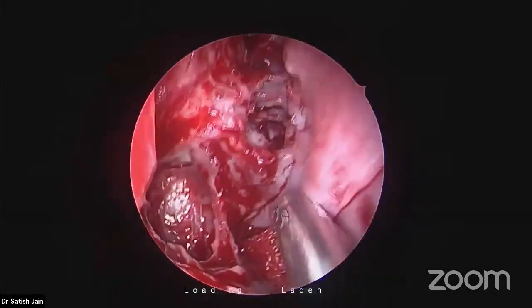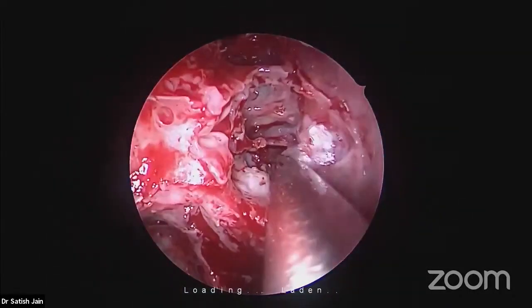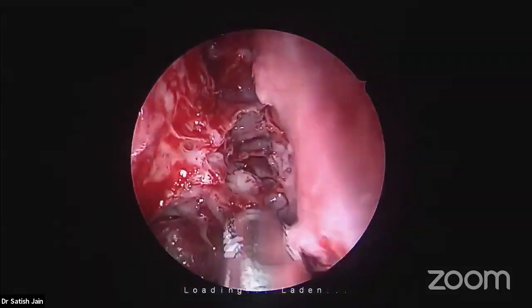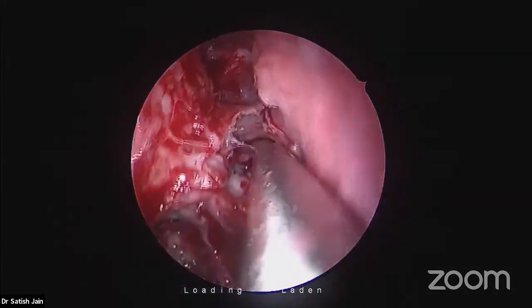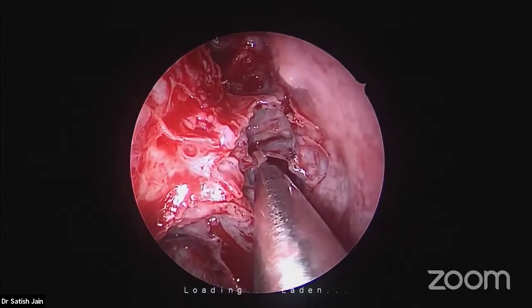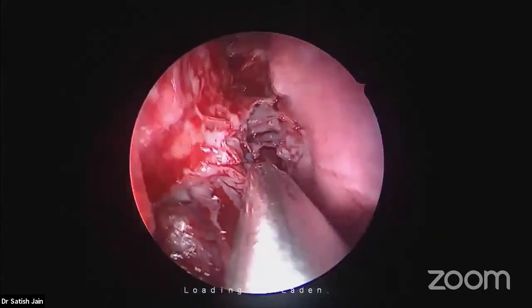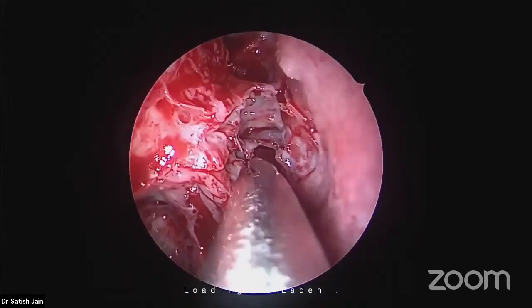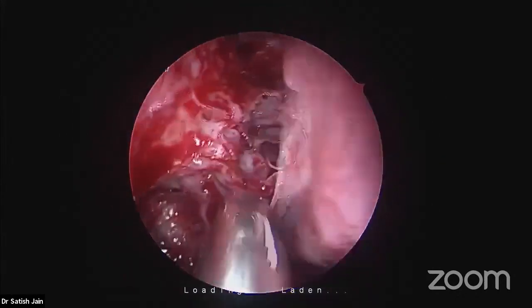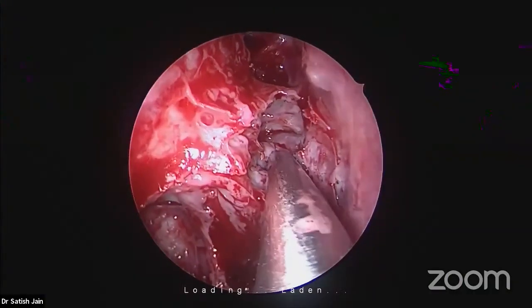Got my point? So the first thing is to use the maxillary line and enter into the posterior ethmoid. Number two, I don't want to complete the posterior ethmoidectomy here, because I don't know where posteriorly I might accidentally enter into the sphenoid and damage the important structures there. So I have to be extra careful. I will not do the posterior ethmoidectomy here first. I will search for some landmark for the posterior limit of the posterior ethmoidectomy so that I don't enter into the sphenoid.